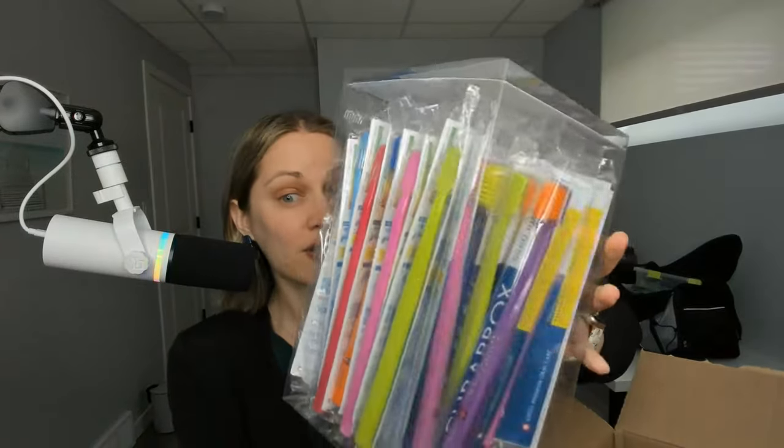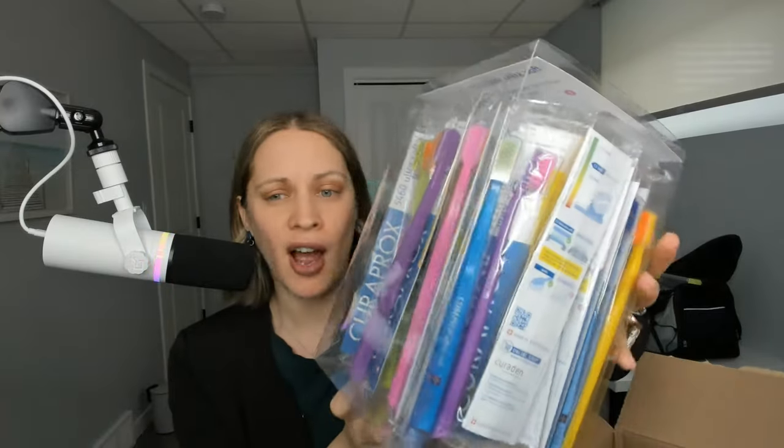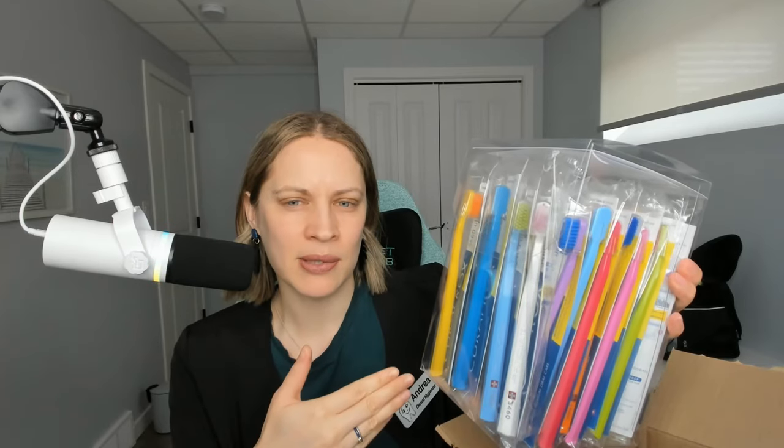My favorite toothbrushes. I love them because they're extra soft and they come in really fun colors. I don't care if you're a child, adult, or senior — I let everybody pick their toothbrush. I basically open up the box and say, what color would you like? Even adults tell me they look forward to that part of their appointment. These are more expensive toothbrushes — about eight dollars retail, but if you get them in bulk they work out to a little under five dollars. I give them to every single patient because they're amazing.